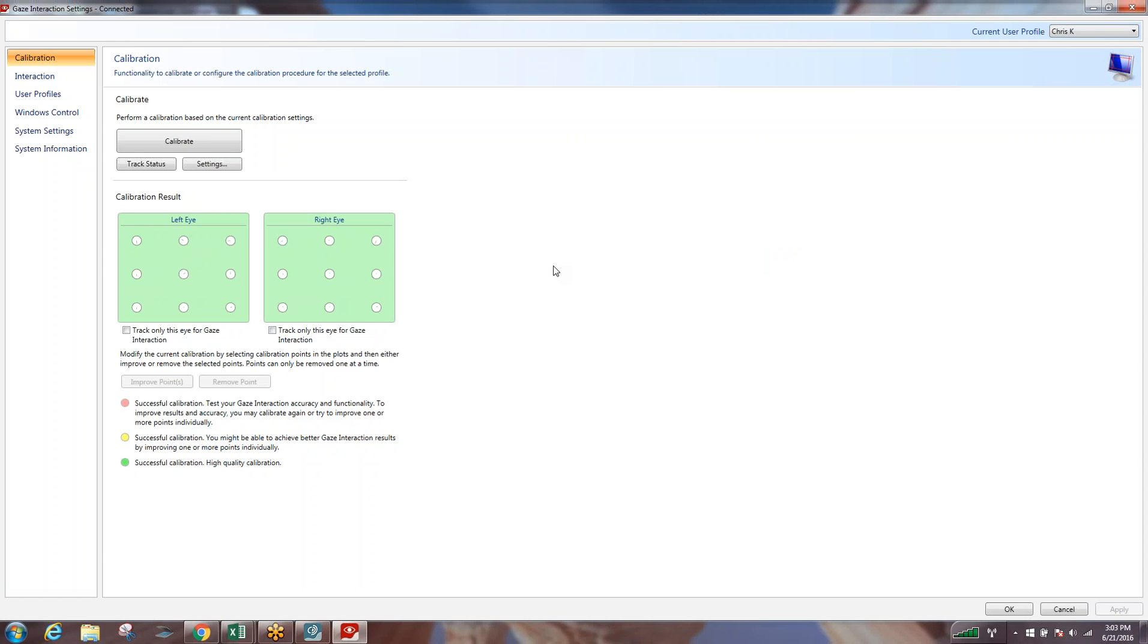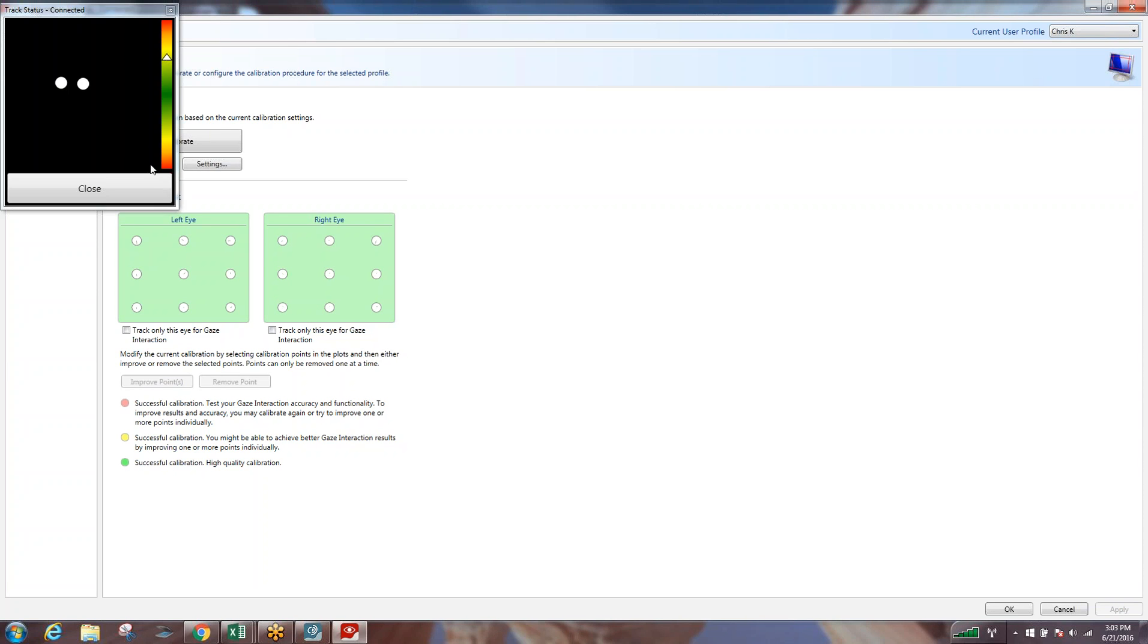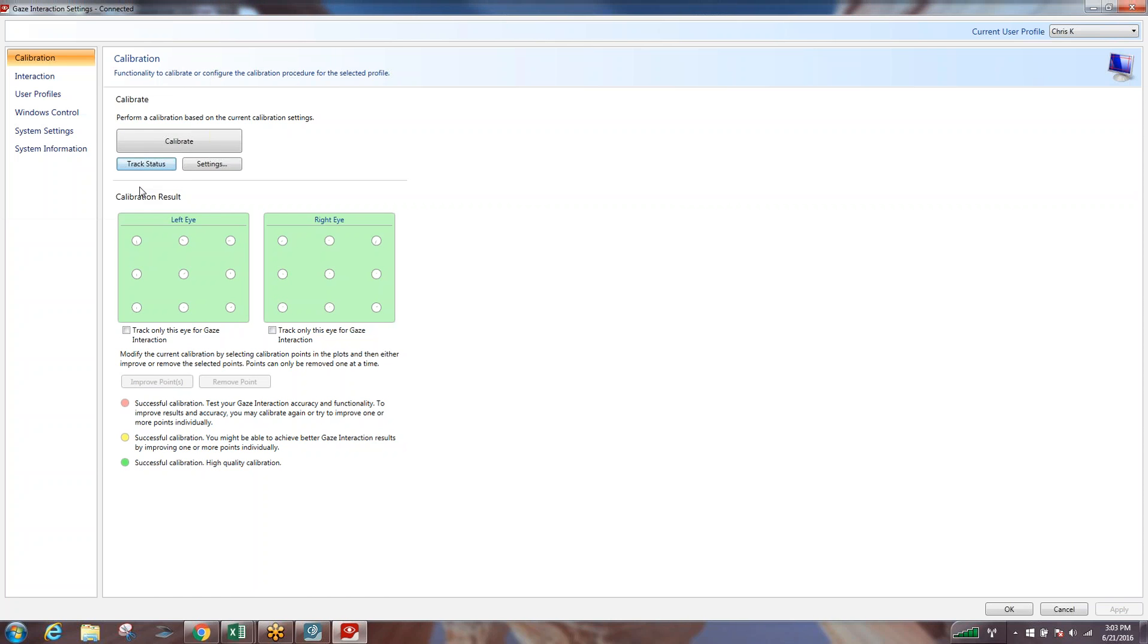The first thing we want to do is make sure that we are in the right position. You can hit the track status box here to let us know where we are so we can play around with that, or on an i-series device, typically the left hand side of the device, the button with two dots, is typically programmed to be a quick toggle on and off for that track status box as well.